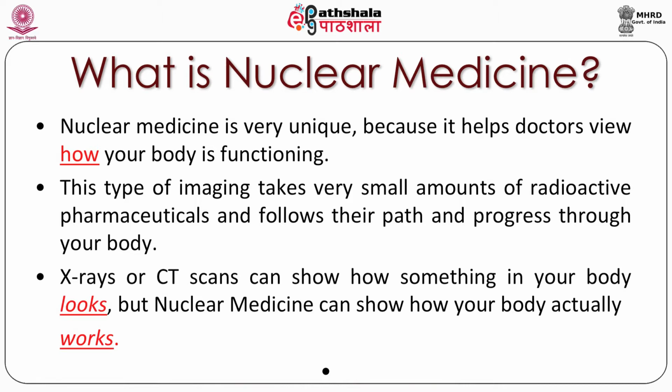X-rays or CT scans can show how something in your body looks, but nuclear medicine can show how your body actually works. It means it is playing a very, very important role. I can give you an example. You have a dead dog or a live dog. When you take a scan using X-rays, you cannot find out whether the dog is dead or alive. But if a similar examination is done by nuclear medicine, you are able to find out that this dog is dead or alive, because it gives the functioning of the body.